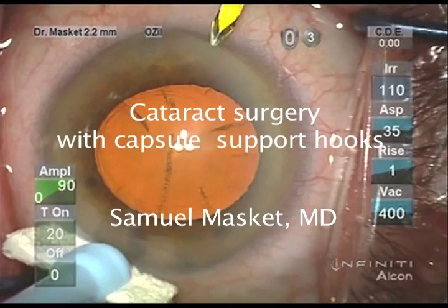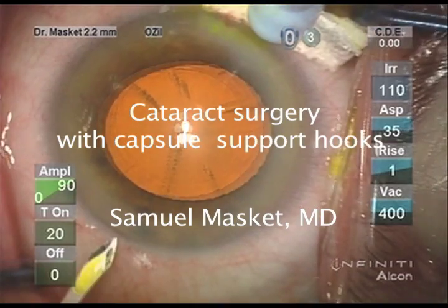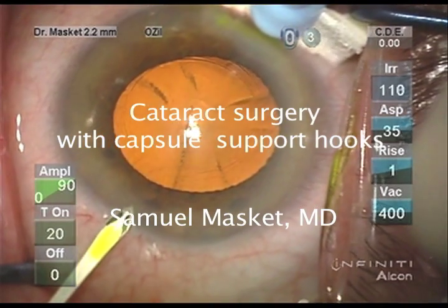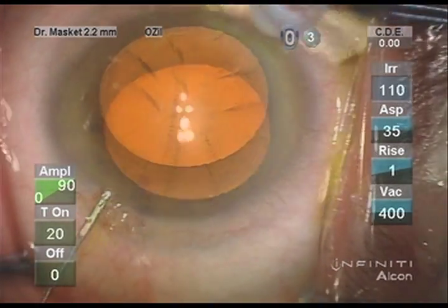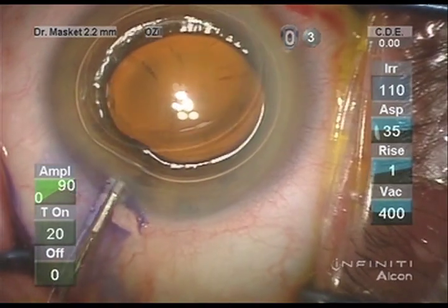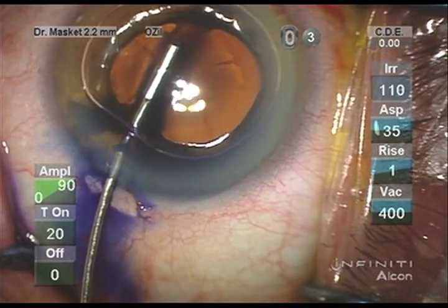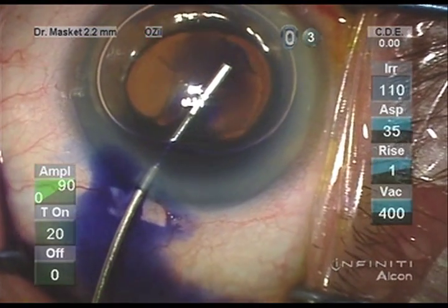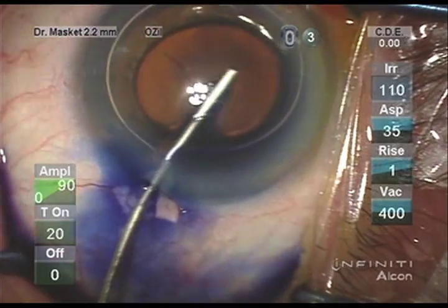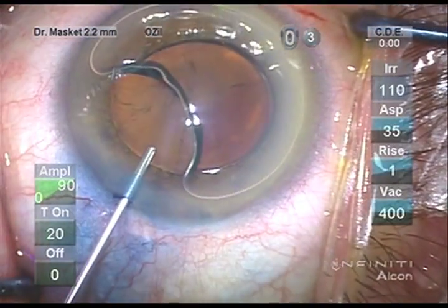An 80-year-old woman with pseudoexfoliation and phacodenesis was referred for cataract surgery. A series of paracenteses is created, followed by trypan blue staining of the anterior capsule. This enhances the ability to see the capsule structures at the time of the capsulotomy, but also later in the procedure should capsule support hooks be necessary.